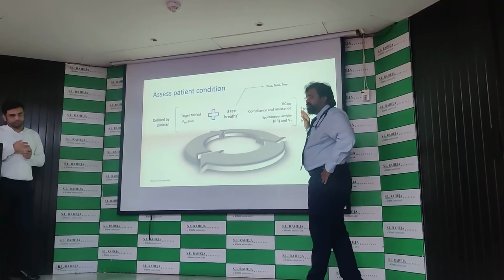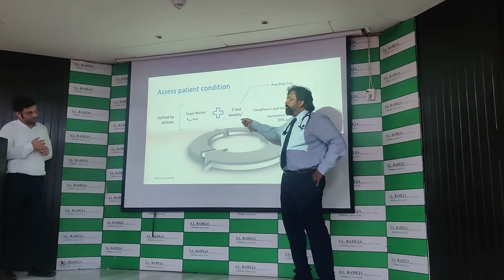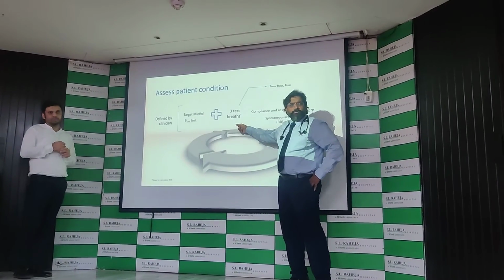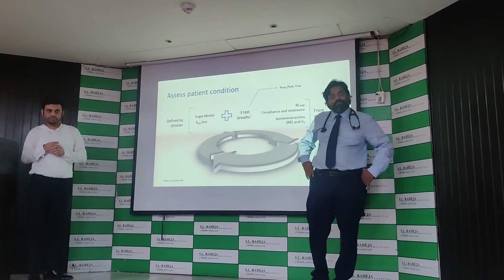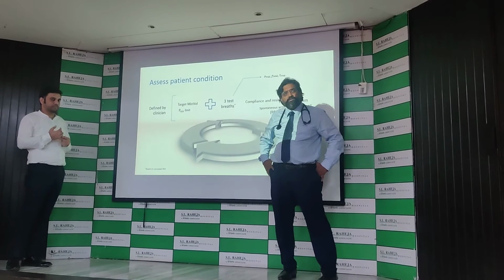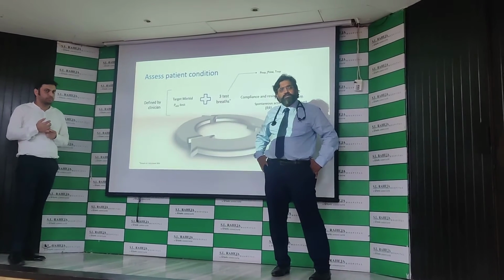This is what occurs. My question was, how often does it do this? Is it only 3 breaths, once in a day? No sir, initially when you set the target minute volume percentage, at that time it will check for all these things.